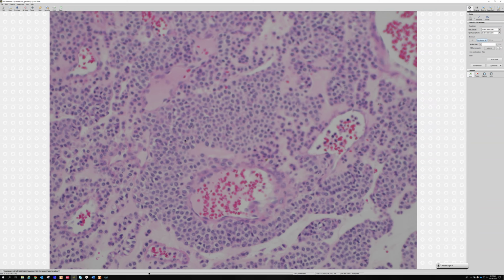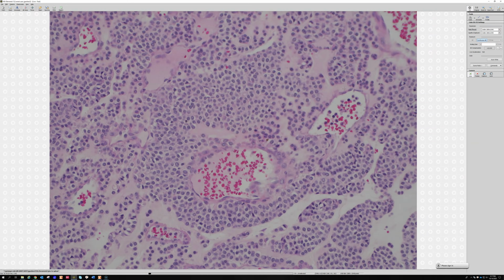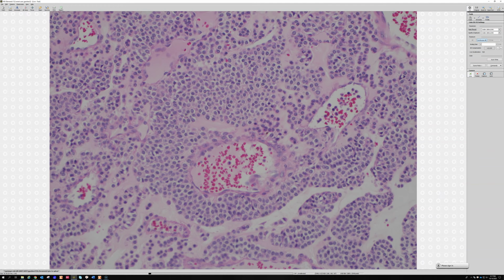So these are actually tumors of what kind of cells? Glomus cells, do you know? I think perivascular. Yeah, they're pericytes, right? They're perivascular modified muscle cells called pericytes. That's the type of cell that the glomus cells are recapitulating. And of course, they're named for these little glomus apparatus that are usually under the nail bed and the fingertips, also known as the canal of Sucquet and Hoyer. And anyone out there who speaks French, I apologize, because I'm sure I'm terribly pronouncing those names, but they're little arteriovenous anastomoses.